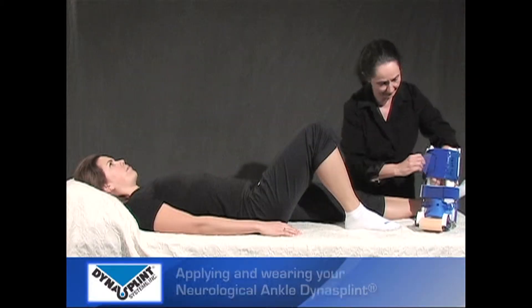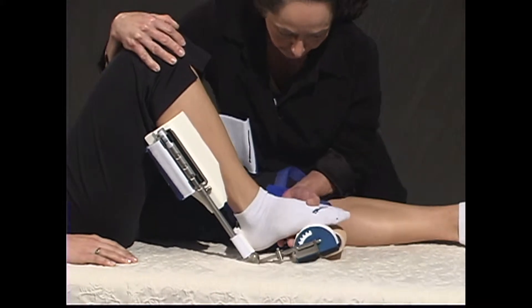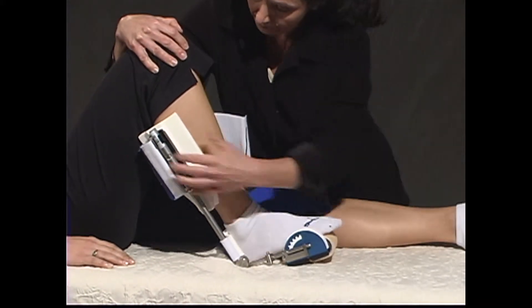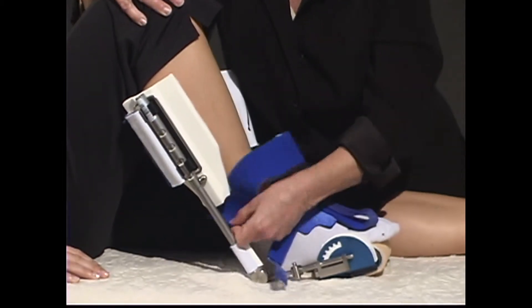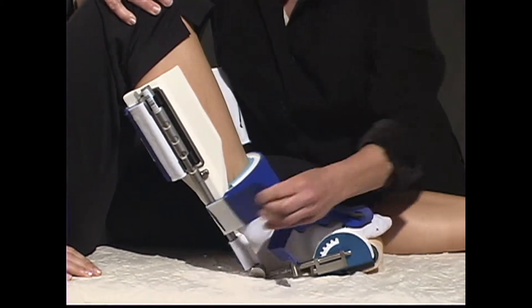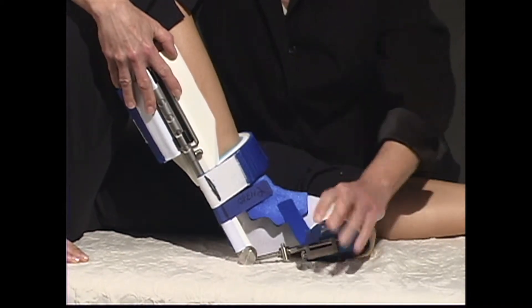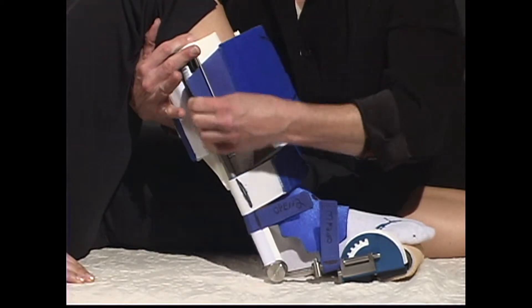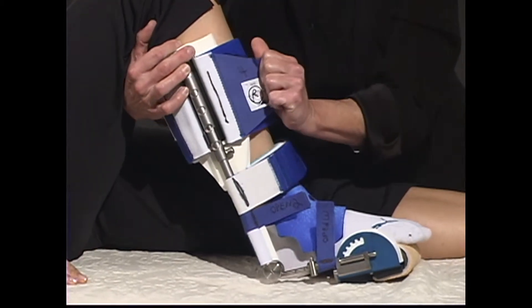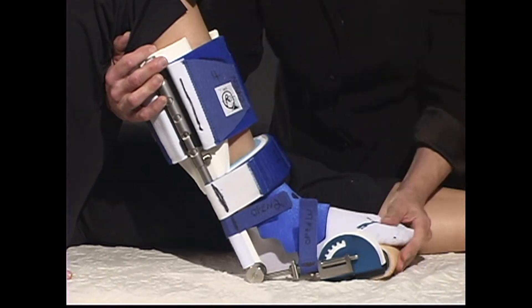To apply the patient's ankle DynaSplint, open all front cuffs and straps. Place the patient's foot on the footplate with the patient's heel touching the back heel strap. Close straps in order: first, the 2-inch shin strap, then the top thin blue butterfly strap, then the lower thin blue butterfly strap, finally the large shin cuff. Pull straps and cuff to the line that the DynaSplint consultant marked on each cuff and strap.